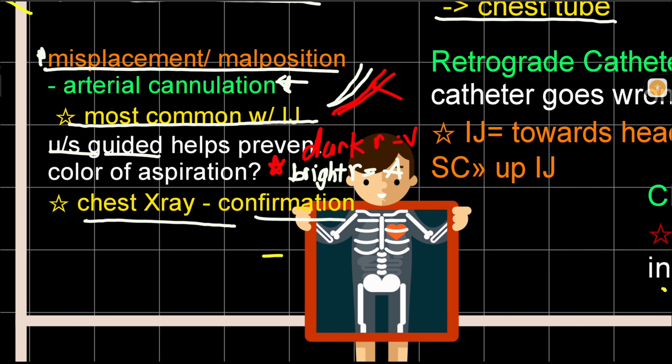Okay, post insertion of your central line, you will normally see that they're gonna do chest x-ray para ma-confirm. Visualization po tayo ng yung central line.